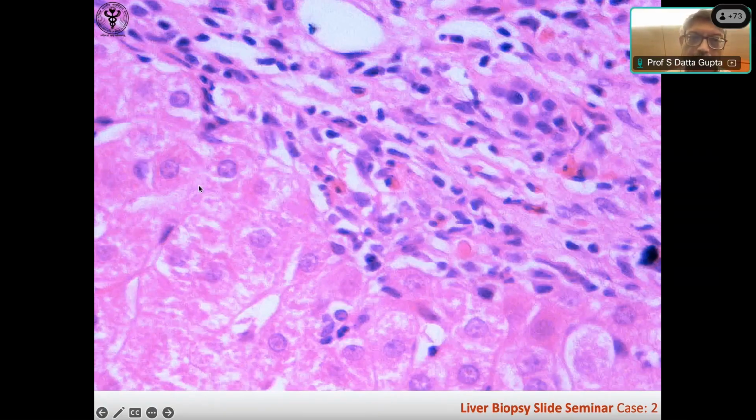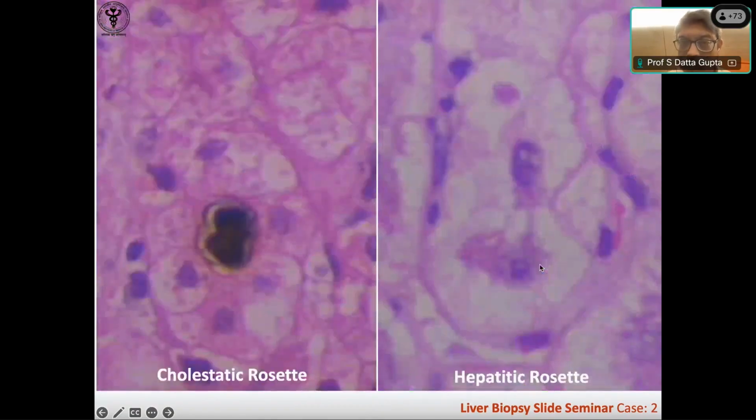And emperipolesis is also there. I thought I saw it somewhere. Okay, anyway, you can see this.